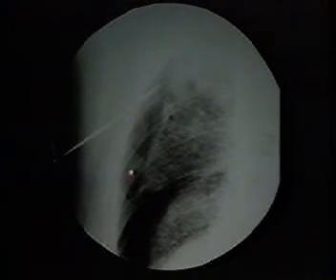the left side down, and you can see the pneumothorax much more easily when you place the non-dependent side up. And you can see the upper lobe and lower lobe here, and you can actually watch under fluoroscopy as you place your trocar catheter into the pleural space. You remove your stylet, and then you simply aspirate some air to make certain that you're in the pleural space, as we've done here. Then you simply, holding your cannula still, slide the catheter gradually off of the cannula, and slide it progressively over the apex of the lung until it lies in the very lung apex, and then attach the catheter to a suction device to evacuate the air.